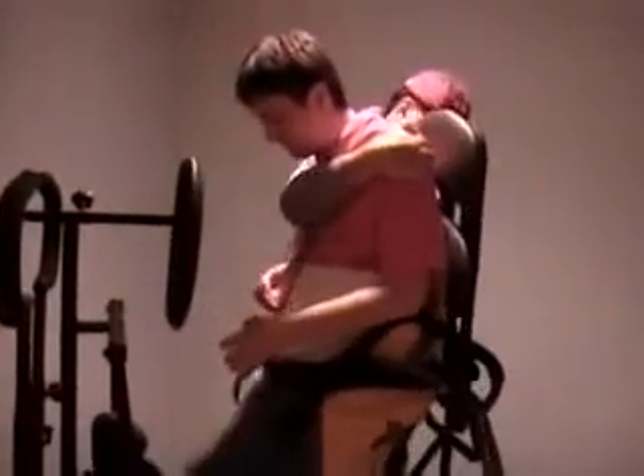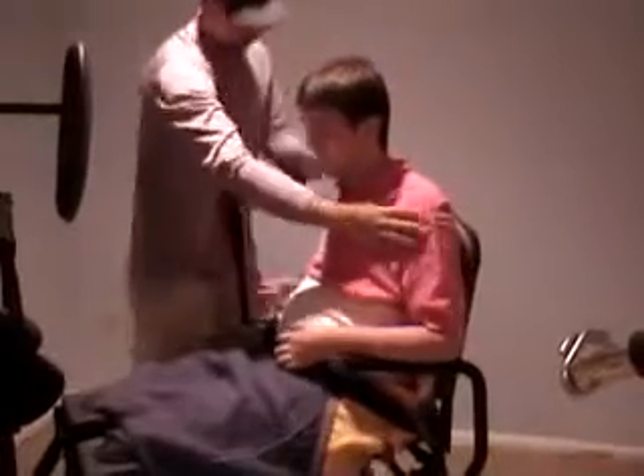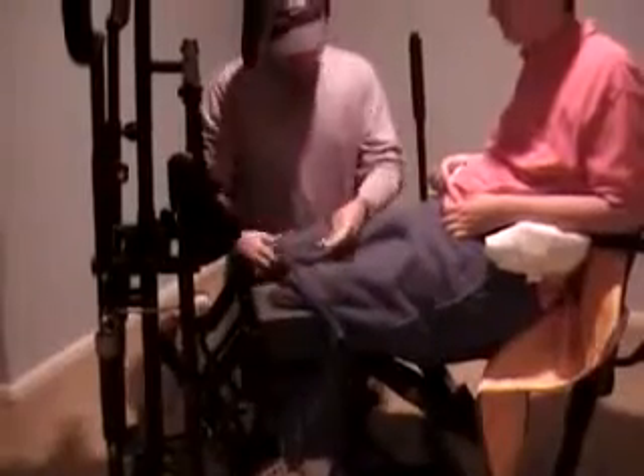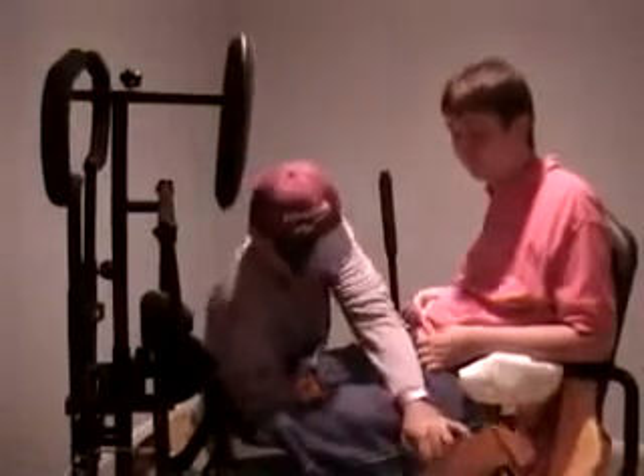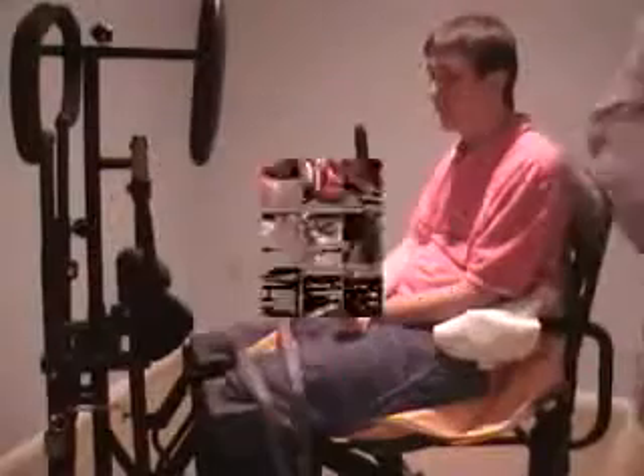There are many benefits to standing. When a person gets injured and acquires a spinal cord injury, they are unfortunately wheelchair bound and lose the ability to stand. But a piece of equipment like the EasyStand 6000 Glider enables an injured person to be able to stand. A person that stands on this frame, whether able-bodied or disabled, benefits from the same things. Having the weight bearing put through your lower body's bones, you are able to benefit by strengthening your bone density.